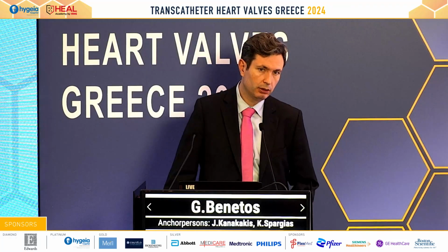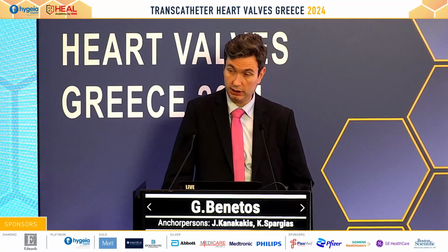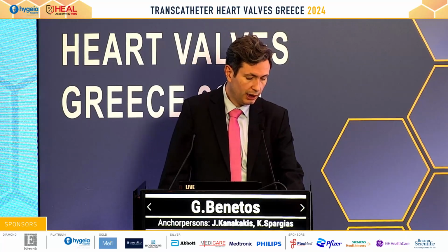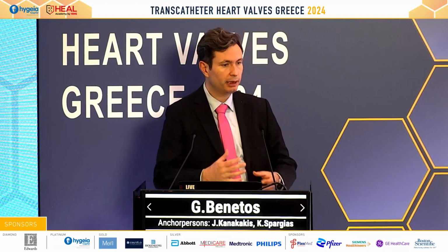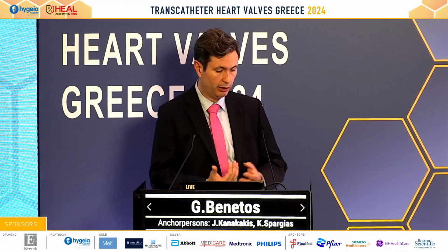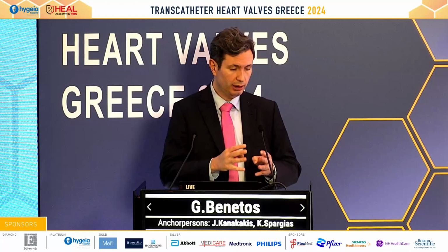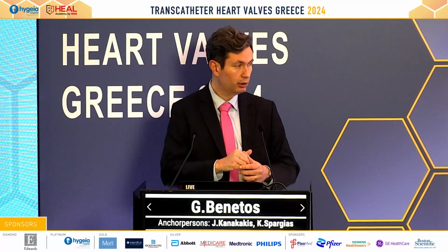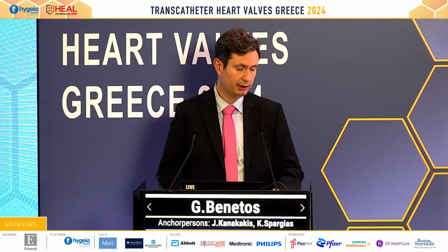I wouldn't depend on the CT. If we are sure from the echo that the aortic stenosis is severe, then I wouldn't deny an operation to a patient according to CT measurements. Sometimes we do a planimetry CT and the stenosis doesn't seem so severe, but the echo report says it is severe. That most of the times has to do with the fact that in CT you measure anatomical structures, but in echocardiography you perform also functional studies. So it's different.